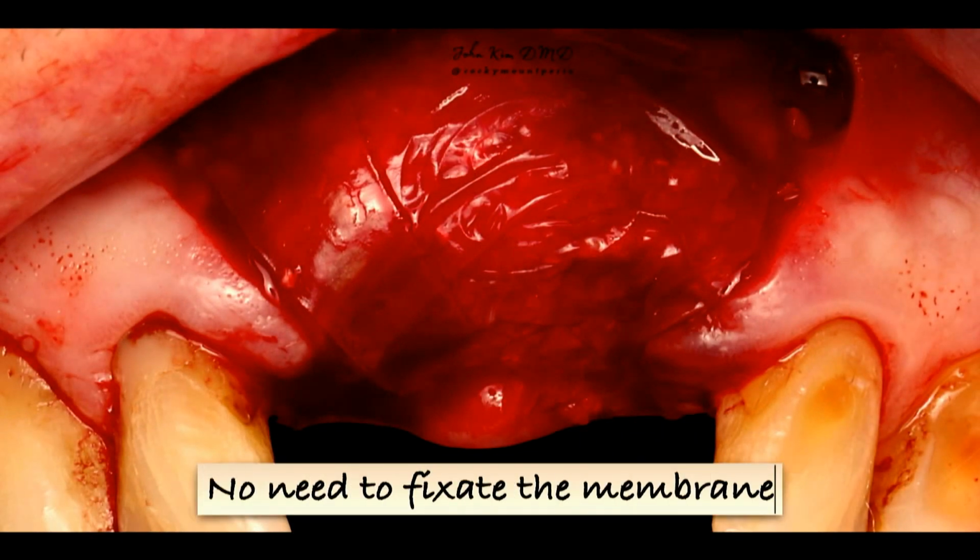This surgery, I hate to revisit because it was extremely hard for me to do. As Matt showed in the prior cases, and if you follow both of us on Instagram or have seen us do these webinars or courses, we quite often will stabilize that membrane with sutures. But this patient bled a lot. It was very hard to work on this case. So I did not have time to stabilize a membrane, and there's really no need to do that with BioXclude, in my opinion, and it also depends on the defect or the ridge deficiency that you're dealing with. But it was nice to have something that I could work with really quickly when I was in a very stressful situation.